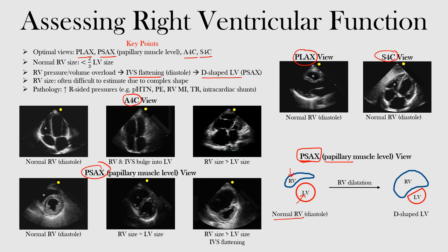If we have an increase in right ventricular pressure or volume overload, we get dilatation of that right ventricle. Normally the right ventricle should be less than two thirds of the left ventricle, but if it dilates, the right ventricle gets enlarged. Notice how much larger the RV now is compared to the left ventricle. In diastole, we get this intraventricular septum flattening and the left ventricle gets this D-shape — almost like a sideways D — because the right ventricle is overloaded and pushing on it.